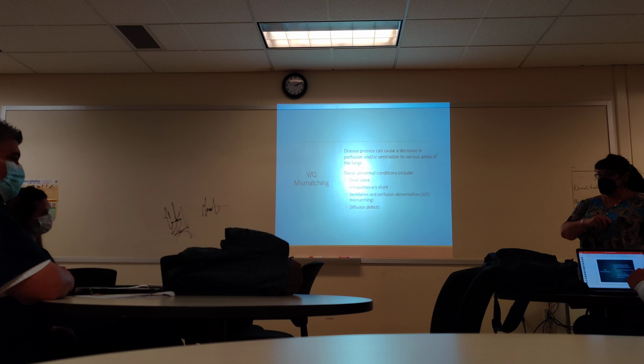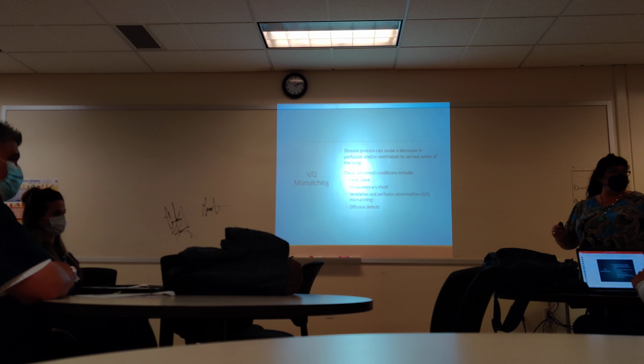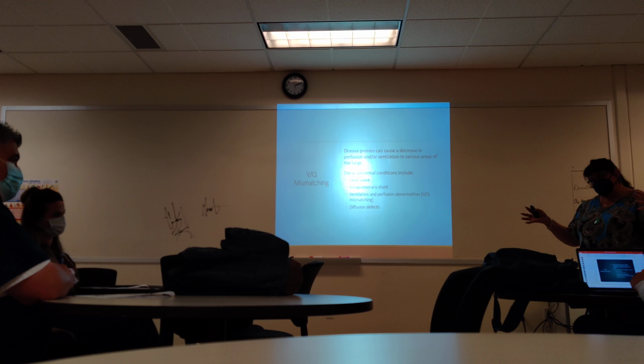Mechanical dead space is anything plastic, including the person's breathing tube, and any space you put between the circuit and the patient. So that is the Ballard. It could be the MDI. Anything that's going to make more dead space is going to make it harder to ventilate the patient.